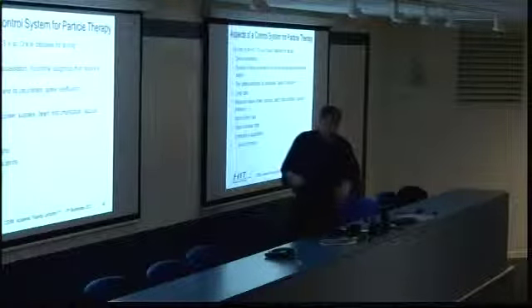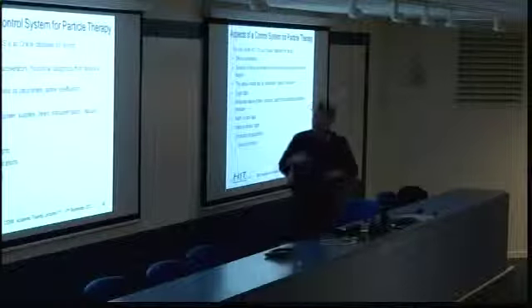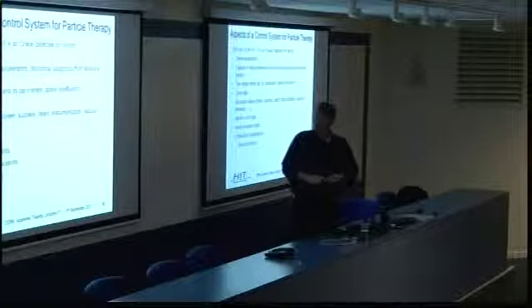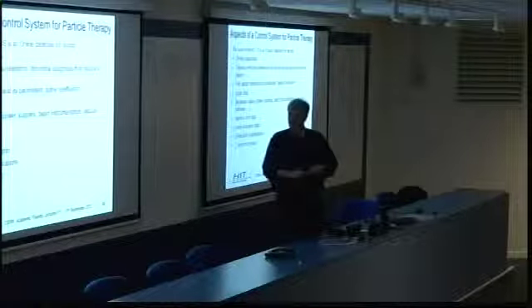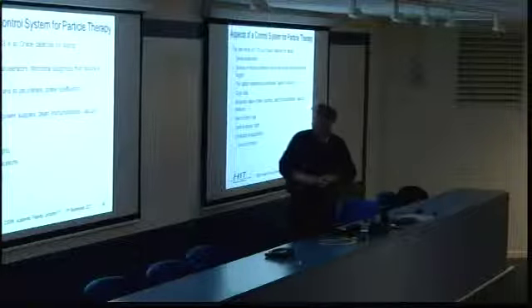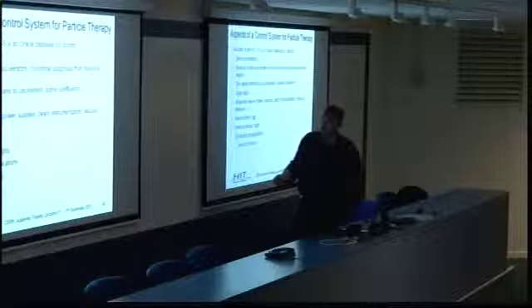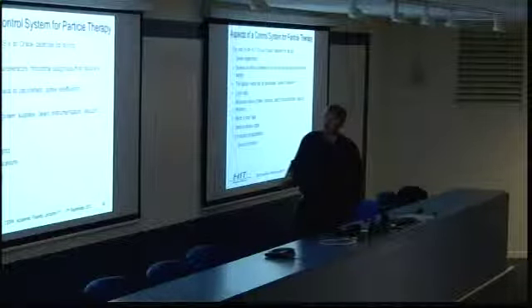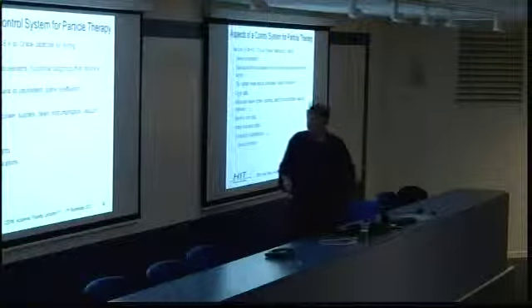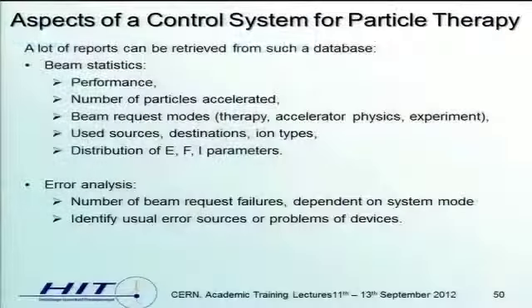All the cycle data, all that is going on in the machine, is stored there. So these are current values from the transformers. These are data from the power supplies, they also measure values, ramp data. Everything goes to this database. And clearly we have alarm and error logs, the user access rights and everything else stored there. This is the heart.